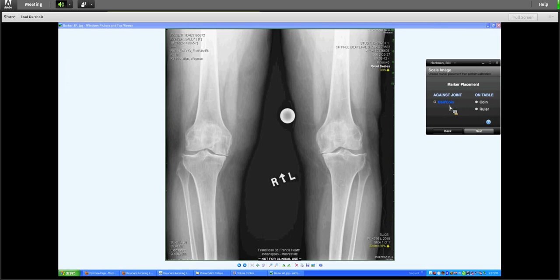But we have an exact protocol that we want everyone to follow for this particular series, because we want it to be as accurate as possible, so the data that's coming into the system is as accurate as possible, so we can validate the size. So Chris and Bryce have been working on some makeshift magnification markers that are going to use a ball, in essence a sphere, not a coin, not just a circle, but an exact sphere. That way, no matter what the rotation is of that particular sphere, we're always going to get the true measurement. And that's represented in this X-ray.